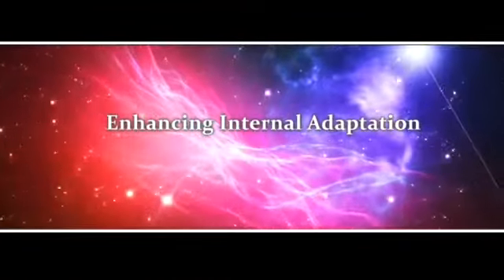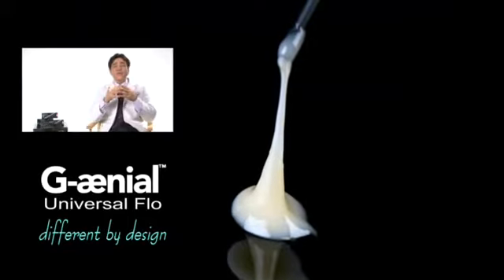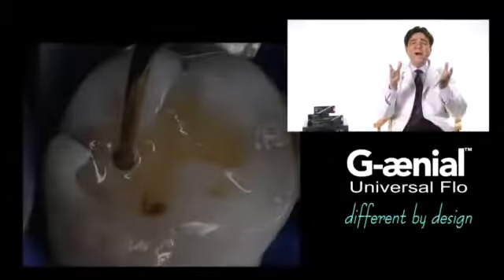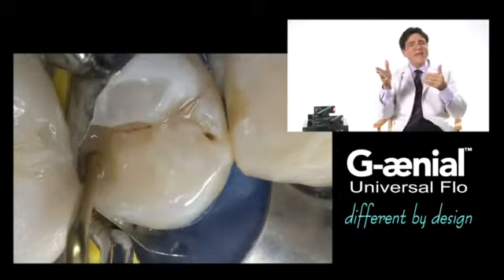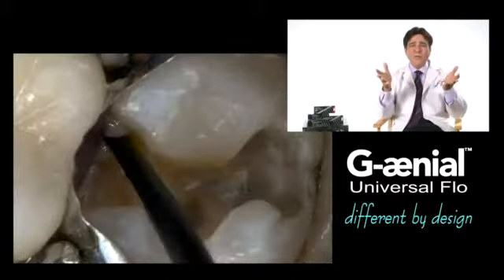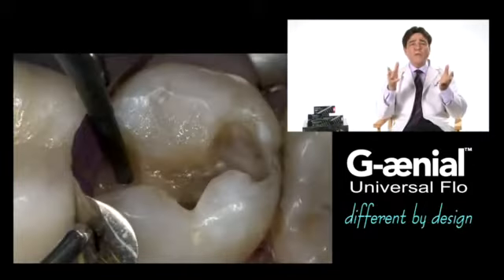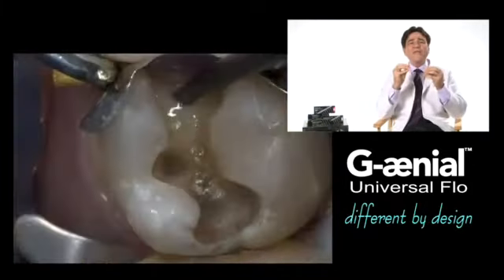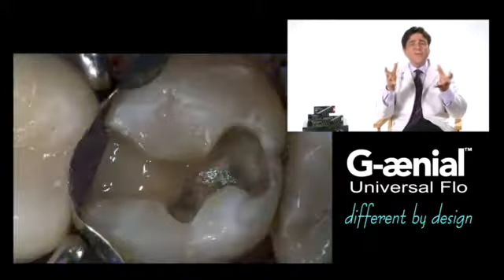To enhance internal adaptation, these next-generation flowable composites, such as G-aenial Universal Flo, are 69% filled by weight, with an average particle size of 200 nanometers. The low modulus composite acts as an elastic buffer that compensates polymerization shrinkage stress by flow, eliminating mastication discomfort and theoretically eliminating cuspal deformation or gap formations and reduced microleakage. Also, the flowable materials may enhance the wetting capacity of the restoration, resulting in a more complete interfacial internal adaptation, reducing void formations, which can contribute to a weakened surface and microleakage.